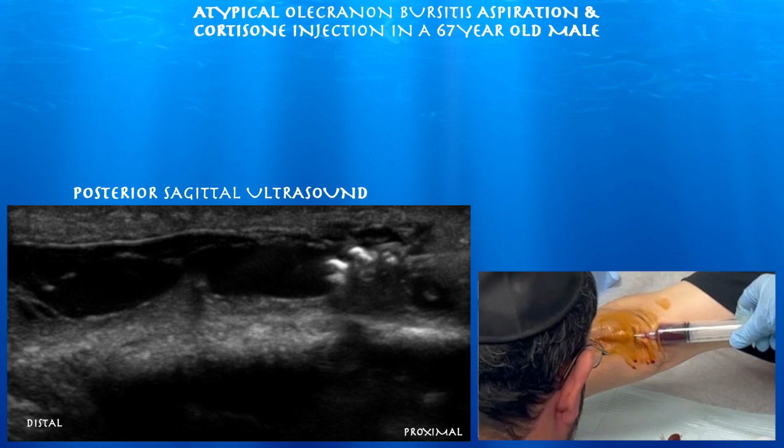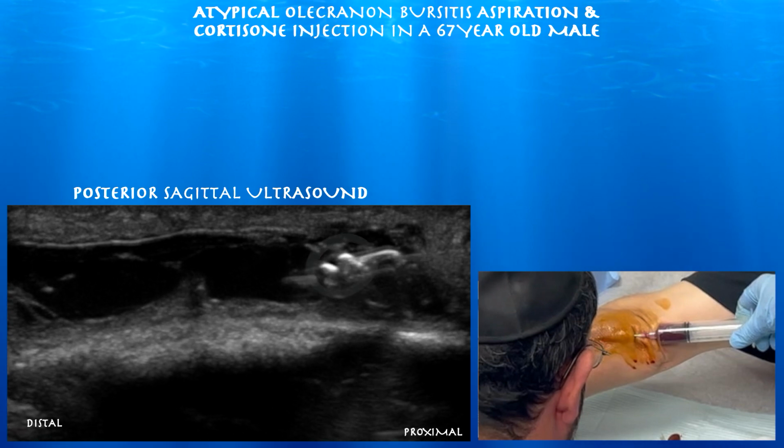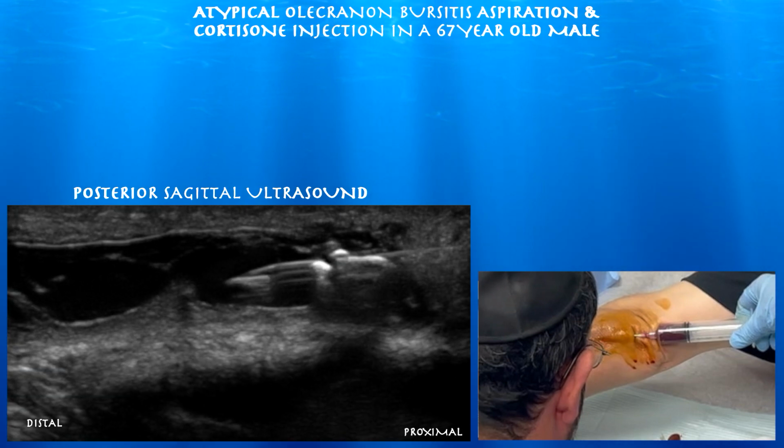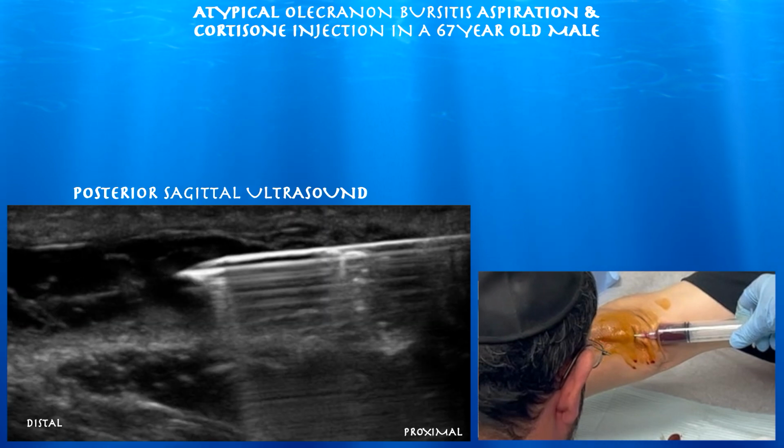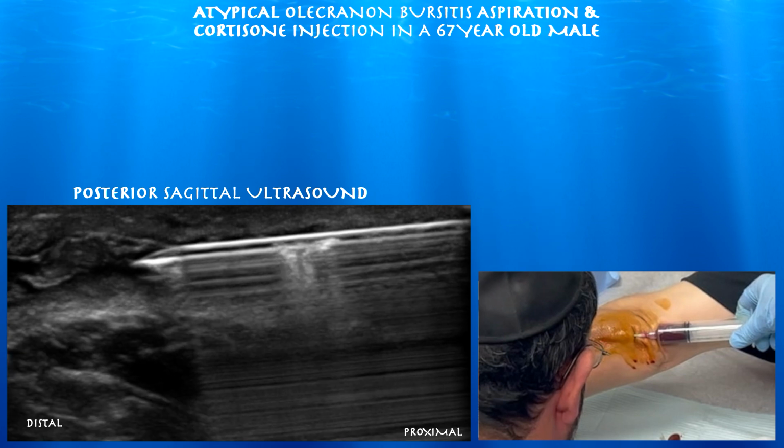This is the approach. It's an in-plane approach. You can see these bright dots in the fluid here, and that's air from the needle going into this bursitis, and I call that a bubble flash sign, which is basically confirmation that we're in the fluid collection.